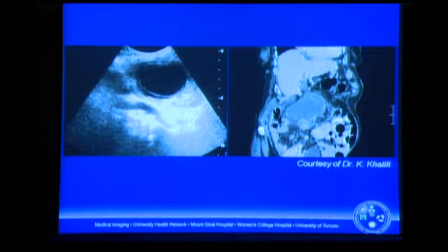This is an example. If I can show you, this patient had acute abdominal pain. We put the probe on where the patient was tender, and it demonstrated this cystic structure with an onion peel appearance to the wall, an edematous wall. Note that that structure just behind is the distal aorta, so that gives you an idea of where that mass was positioned. It was here in the mid-abdomen. And again, if you're unsure, we didn't tweak to the diagnosis using ultrasound in this case.